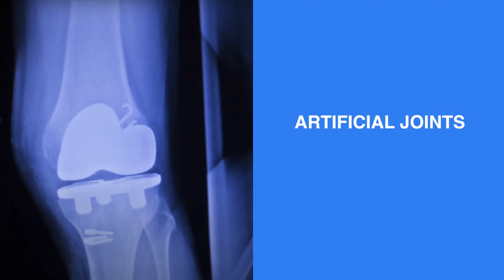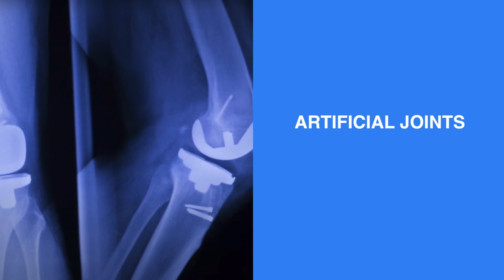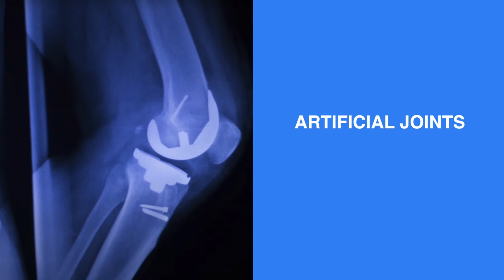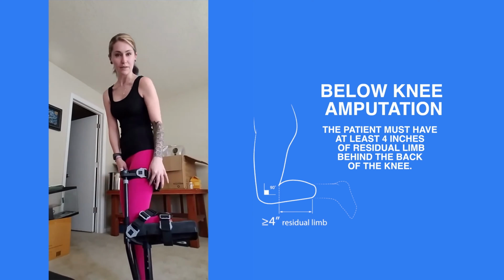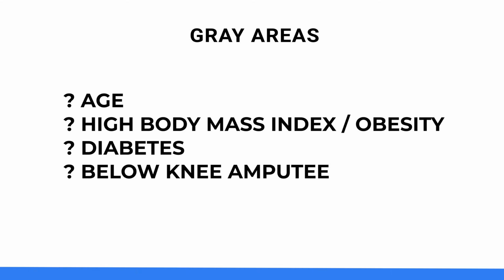Artificial joints. Hip, knee, or ankle replacements can make it more difficult or impossible for your patient to adapt to the iWALK crutch. Below knee amputation. The patient must have at least 4 inches of residual limb behind the back of the knee. All of these other conditions present unique, individualized challenges and must be assessed on a case-by-case basis.